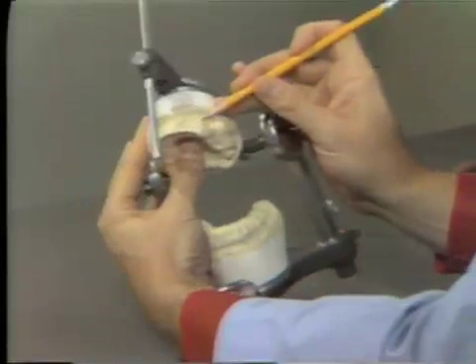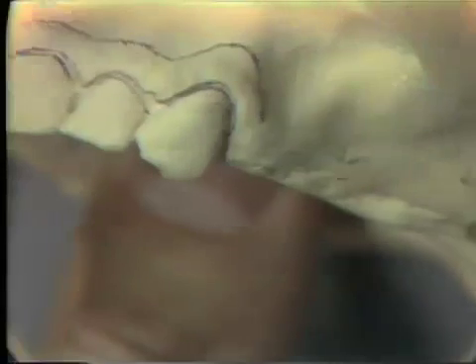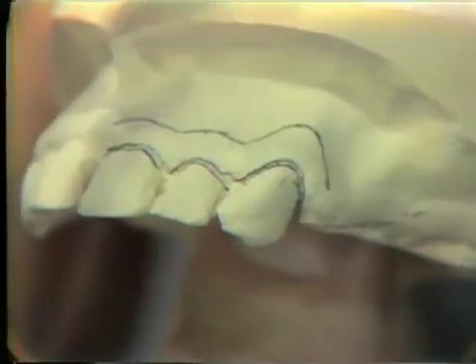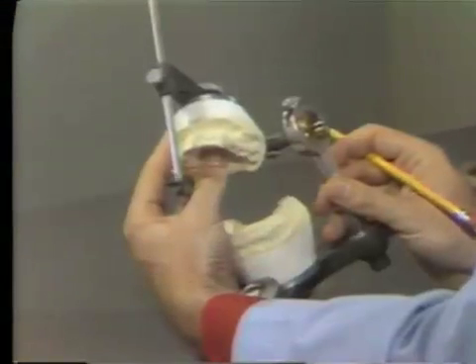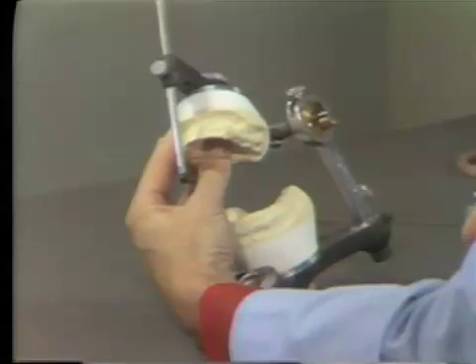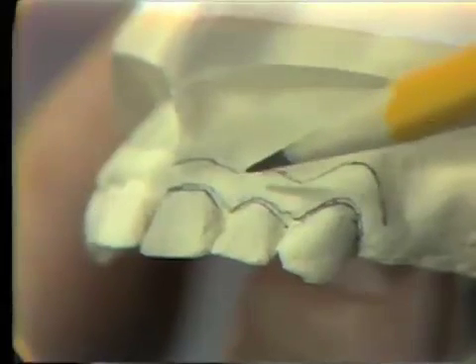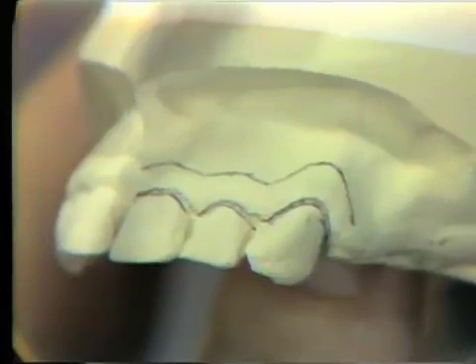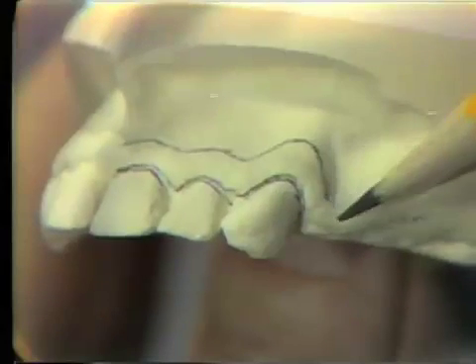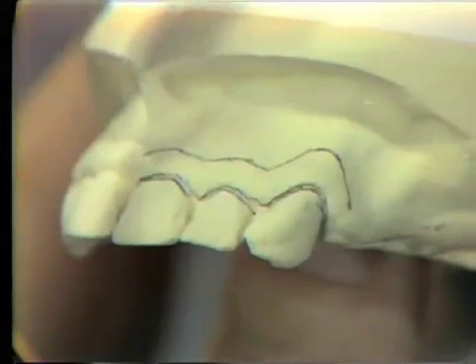In the cuspid area, I'm going to move that line a little bit higher than the two millimeters. This line simulates approximately the amount of contouring we will need to do surgically on the patient's alveolar bone. This determination is done from several diagnostic aids: we use the perioprobe to probe the pocket depth to give us some indication of the height of the alveolar bone, and we also use the patient's radiographs to see the bone level. The lines and the amount of stone we remove from the cast are dictated by these diagnostic aids as to the level of bone for each individual patient.